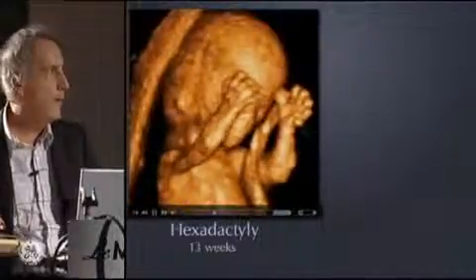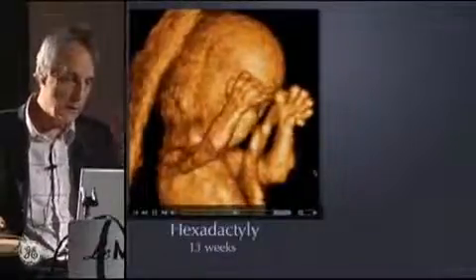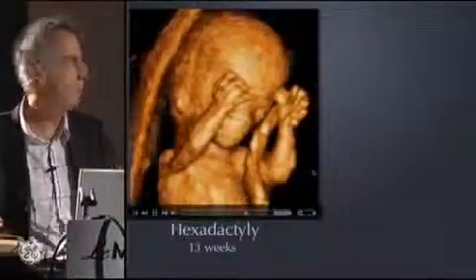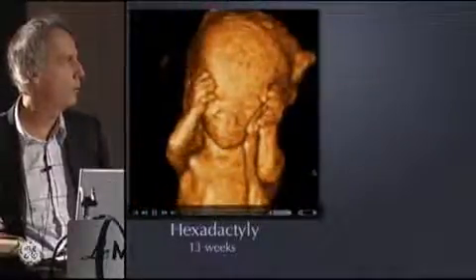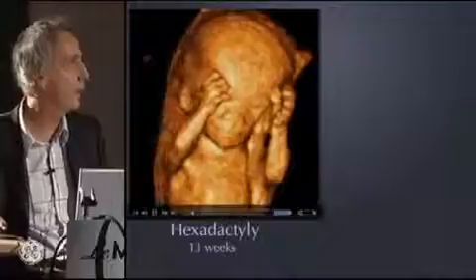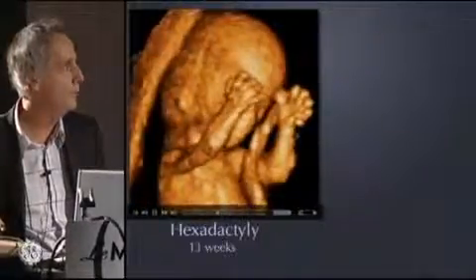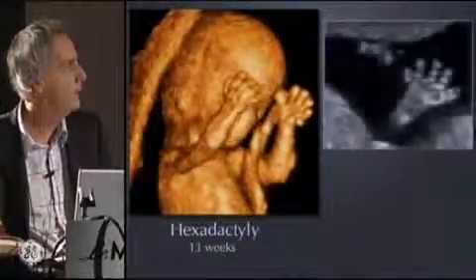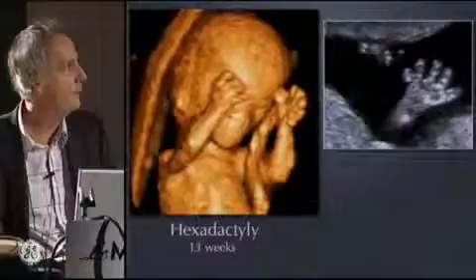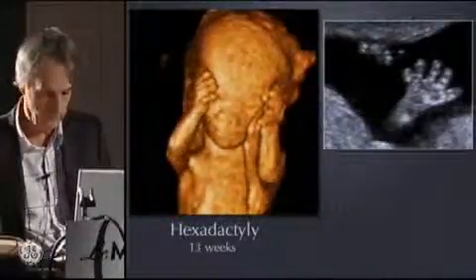This one, postaxial hexadactyly. I did the scan with 2D ultrasound, and when the scan was finished, I saved some blocks. For me, the examination was normal, and after, I worked with the blocks, doing a 3D rendering, and on the 3D rendering, I saw this, but I missed it with 2D ultrasound. After, I took the lady again, and you can see with 2D ultrasound the postaxial hexadactyly here.